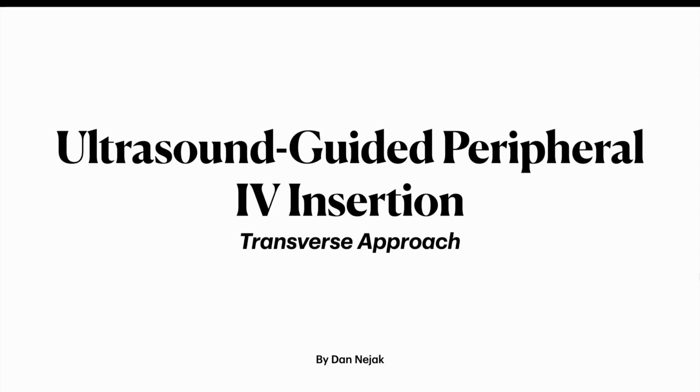Kia ora everyone, and welcome to a lecture on ultrasound-guided peripheral IV insertion utilizing a transverse approach.